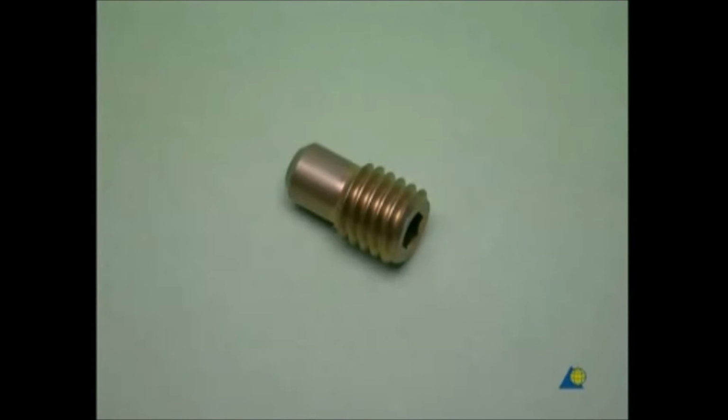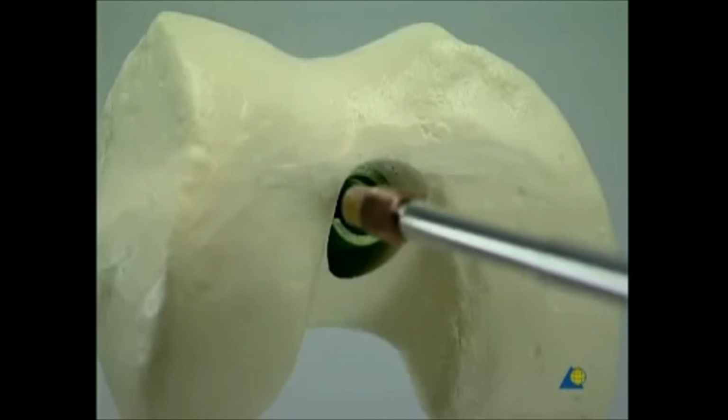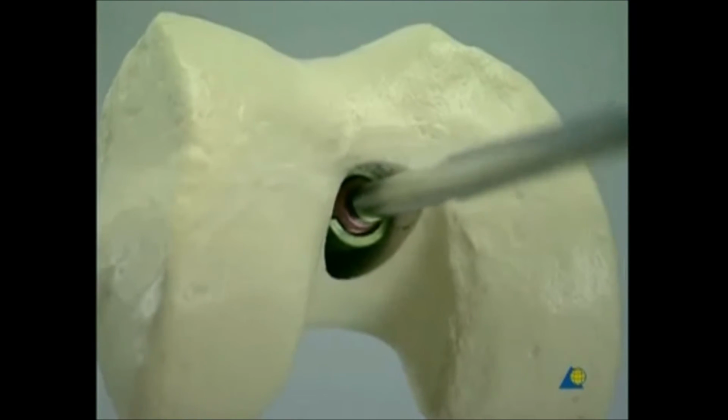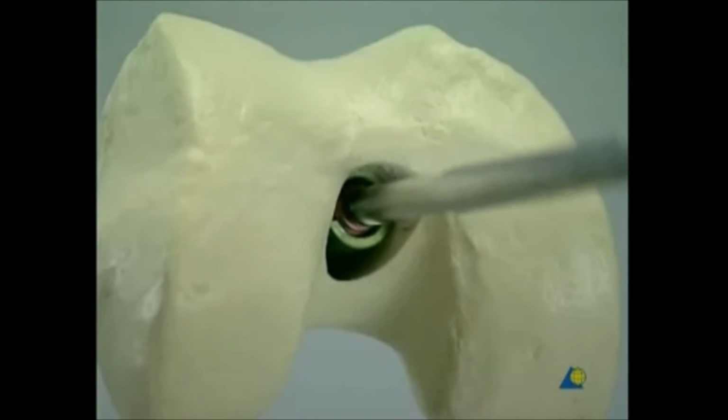Now the end cap must be inserted. As it fulfills 3 functions, its use is mandatory. It prevents bone ingrowth into the nail, locks the spiral blade at a stable angle, and prevents it from loosening. Using the screwdriver, the end cap is aligned with the longitudinal axis of the nail and screwed in tightly.